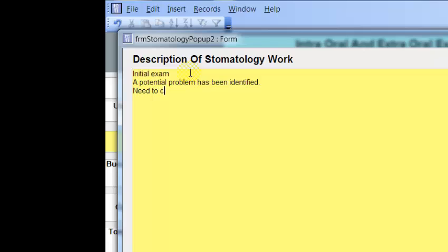Need to call in a stomatology specialist. We'll set a follow-up exam in about 2 weeks from today.